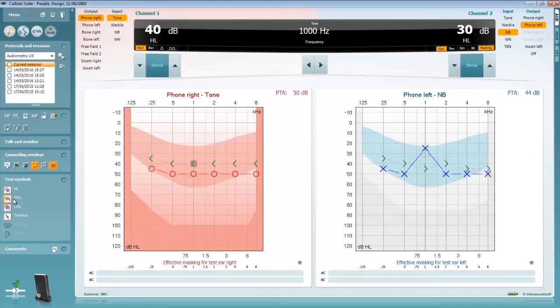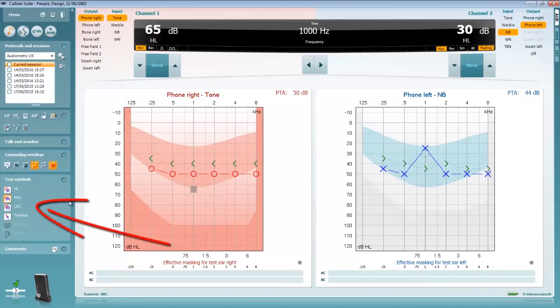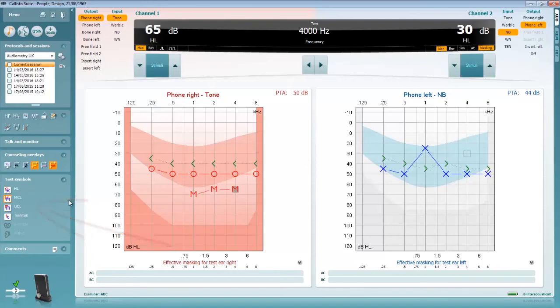Should you wish to make measurements other than just threshold measurements then you can select most comfortable level or uncomfortable loudness level. Selecting either of these will change the symbol sets. Operations of these other tests are performed in the same way as instructed previously in this video.